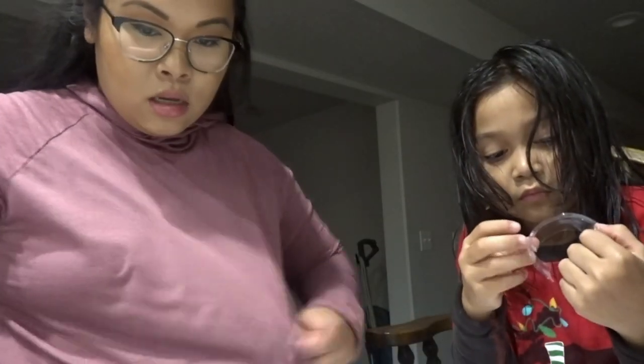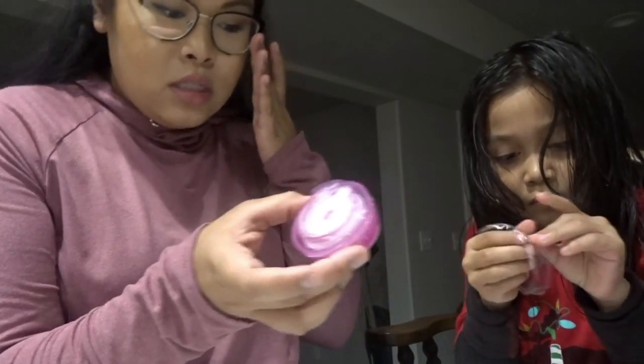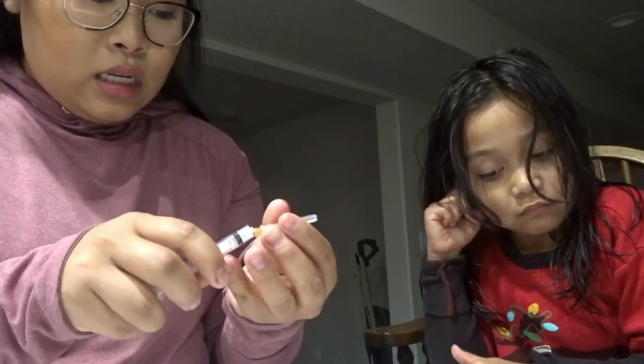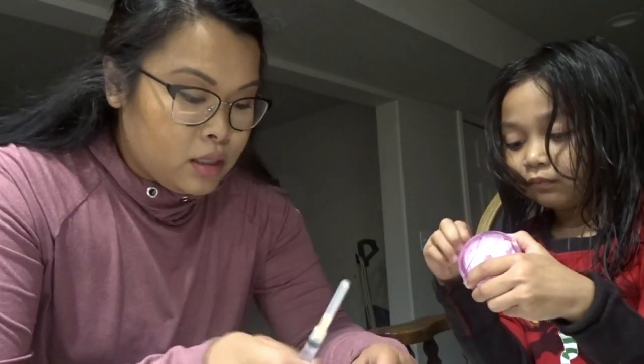Now we're done with the Dexcom - let's do the pump site. You're going to need your pump, the infusion site, your needle and syringe, and the insulin - the most important part is the insulin.